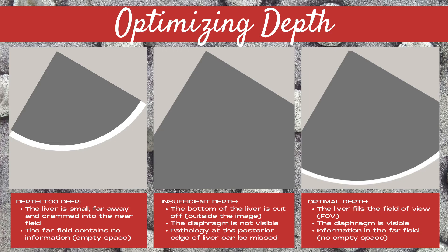In the middle image, there's insufficient depth. The bottom part of the liver is cut off — it's outside of the image. The diaphragm of the liver at the posterior margin of the liver is not visible, and this means that pathology at the posterior edge of the liver can be missed.